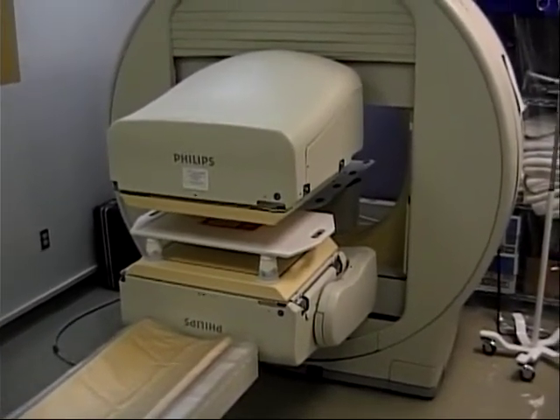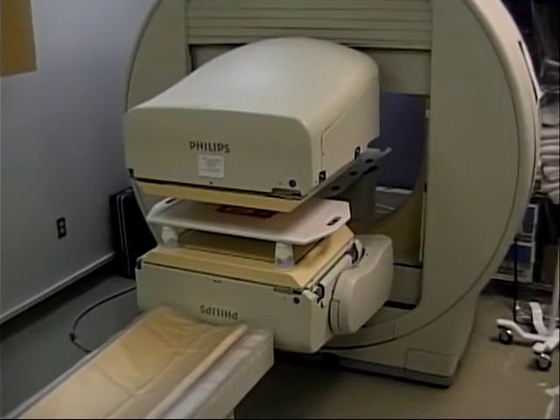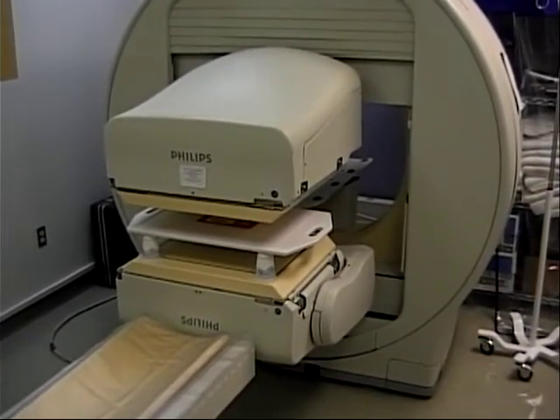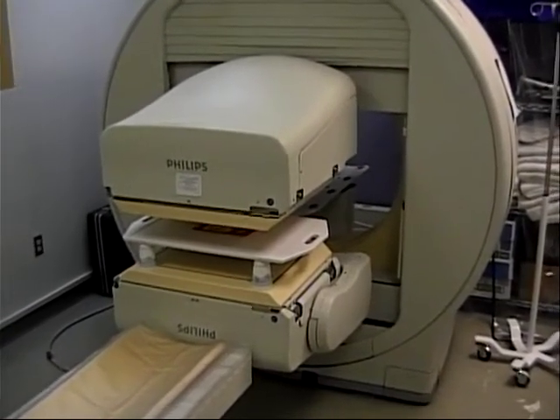Now, if you're wondering where the defect actually is, there's one good test to do on the camera to check to see if it's the crystal, and that test is called an off-peak flood image.